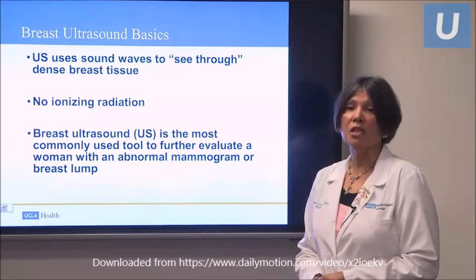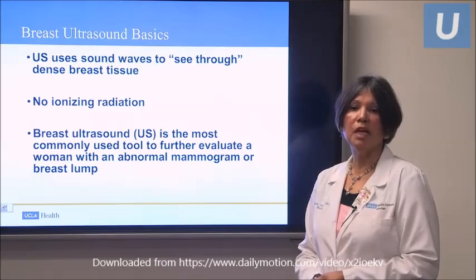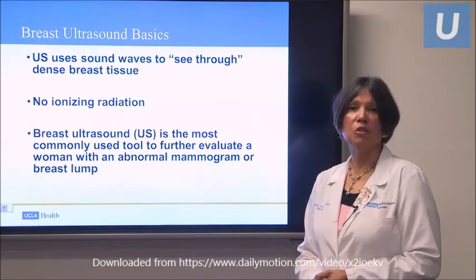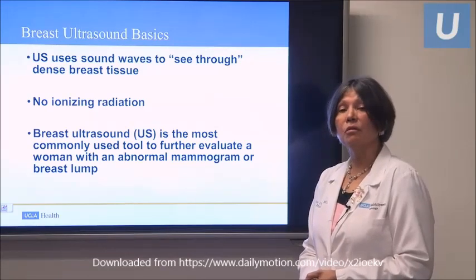We commonly use it every day for diagnostic imaging. Again, for those women who come in with a palpable lump or an abnormal mammogram, we further evaluate with additional imaging with mammography and also with ultrasound.